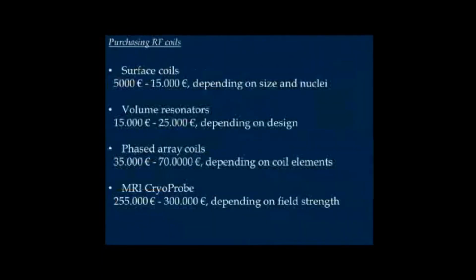And just to give you an idea, you can build your coils yourself. Easy coils, no problem, and it is worth it if you do so, because coils are dear. This is just a rough estimate on the prices of RF coils.